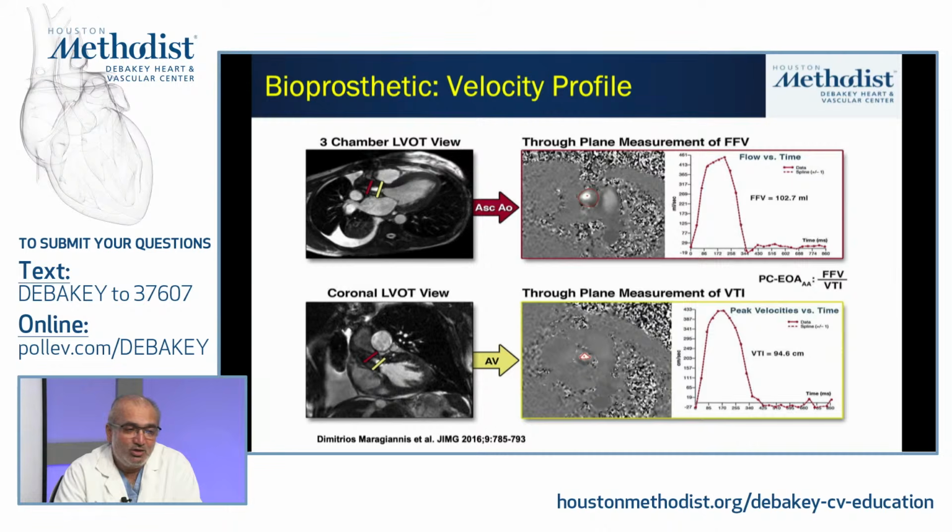valve, and then use a methodology analogous to what's used in echocardiography, where you're basing it on the principle of conservation of flow, and essentially come up with a time velocity integral at the valve prosthesis itself, a time velocity integral at a location either subvalvular or supravalvular, and then measuring the area of the reference region, supravalvular or subvalvular, and using that to compute an effective orifice area.